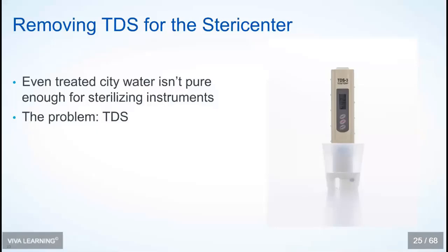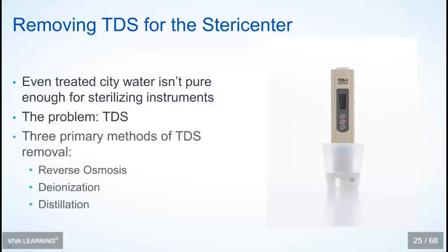So imagine you had 2 buckets of pure water, and you put a handful of sand in one of the buckets, and you put a handful of sugar in the other bucket. If you stirred up that bucket with the sand and then you poured it through a coffee filter, those suspended solids would in fact be removed. But on the other hand, the sugar, which is the totally dissolved solids, if you would pour it through a filter, would not be removed. So just a little bit of a way to think about the difference between suspended and dissolved solids.